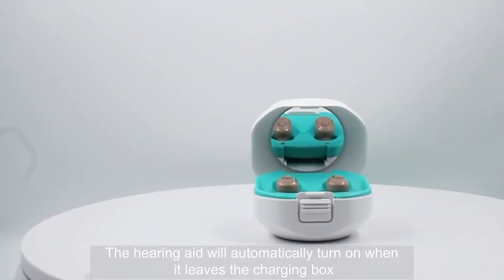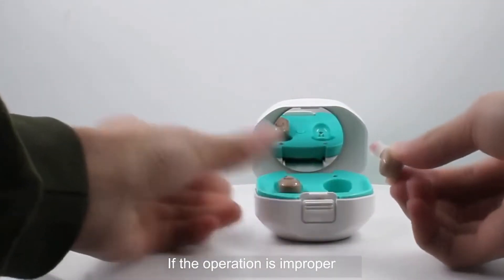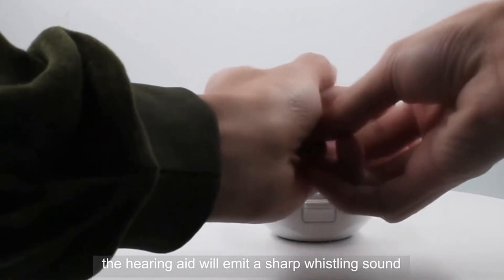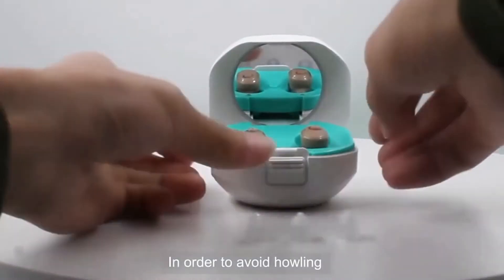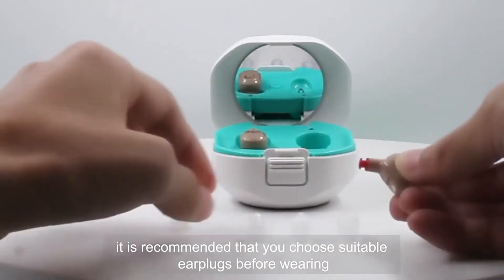The hearing aid will automatically turn on when it leaves the charging box. If the operation is improper, the hearing aid will emit a sharp whistling sound. In order to avoid howling, it is recommended that you choose suitable ear plugs before wearing.